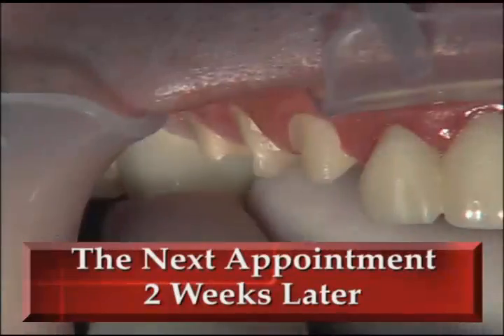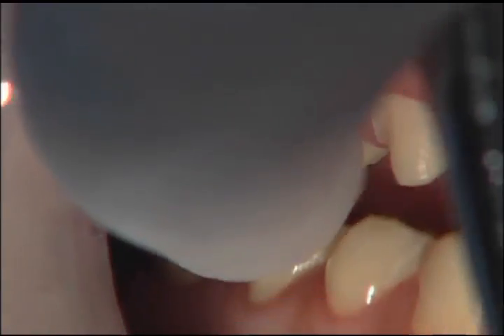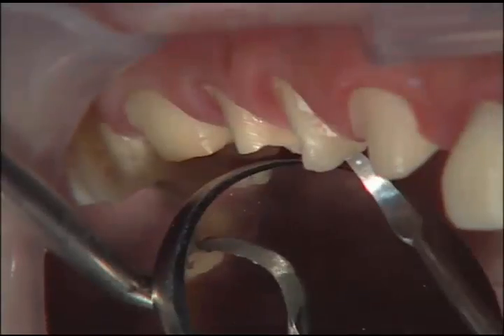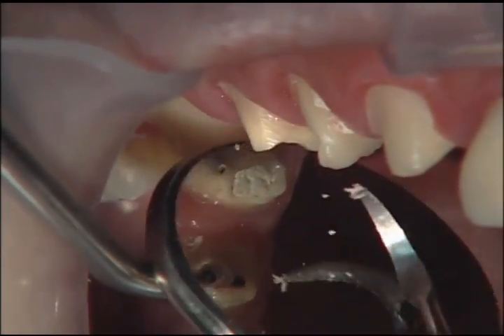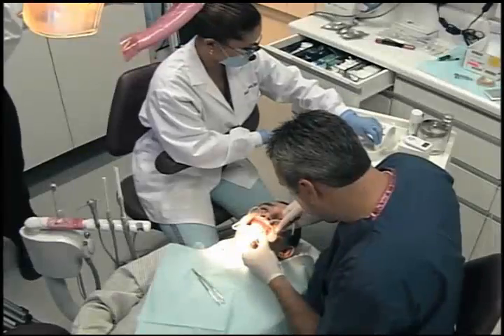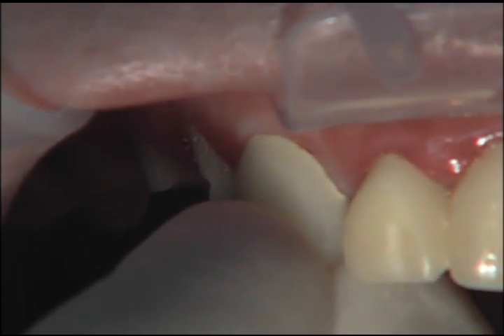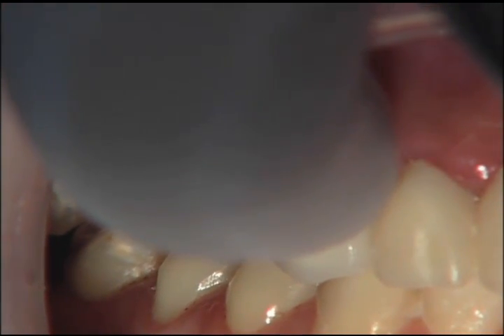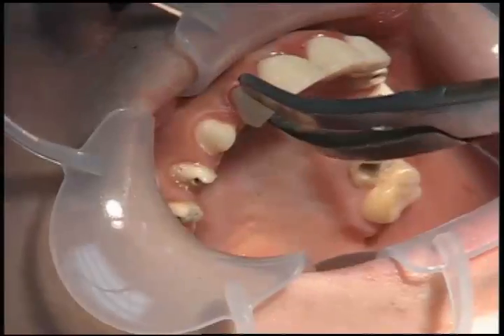About two weeks later, we get the patient back and we have the final CapTech crowns ready to be tried in. We try these in one at a time to check for marginal fit with an explorer, and then we can begin to check contacts as we put multiple units in place. If the units aren't staying in place, we'll go ahead and use some try-in cement. I'm using a scaler just to make sure all the temporary cement is removed from the teeth — this is the number one preventable reason for crowns not seating when they come back. Since the patient is anesthetized, I can use a CAVO sonic scaler to remove any temporary cement I can't get off with a hand scaler, especially if we've used Duralon as our temporary cement.